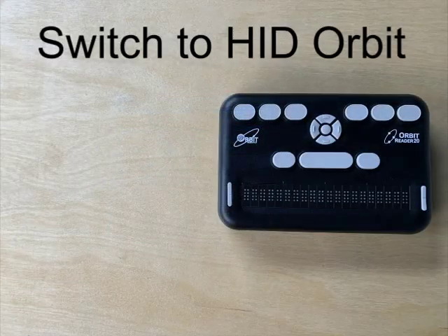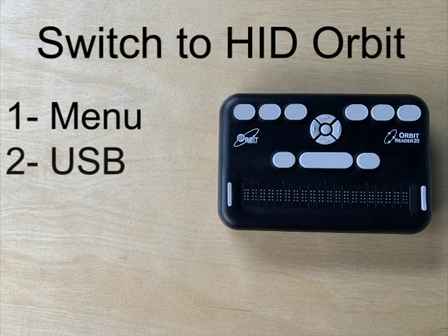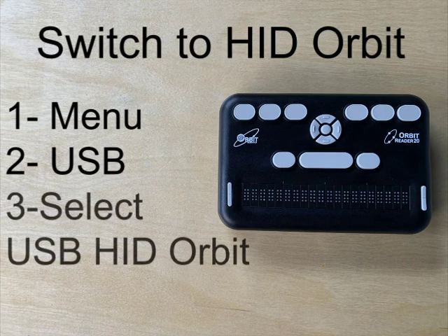To connect with USB, switch to HID Orbit protocol on the Orbit Reader 20 by going to the menu, then USB, and then select USB HID Orbit.